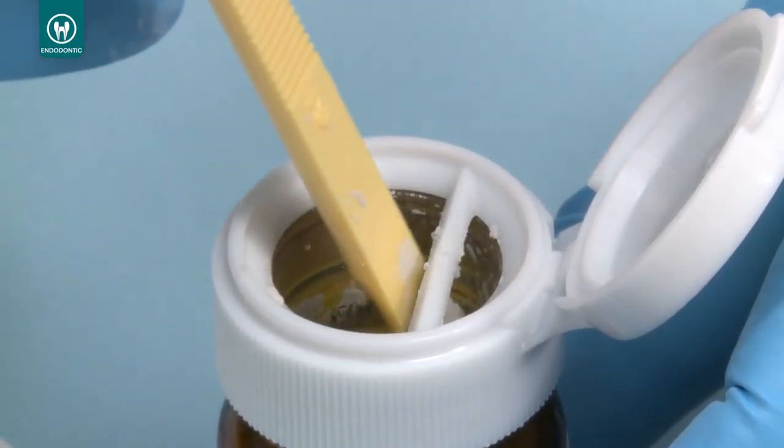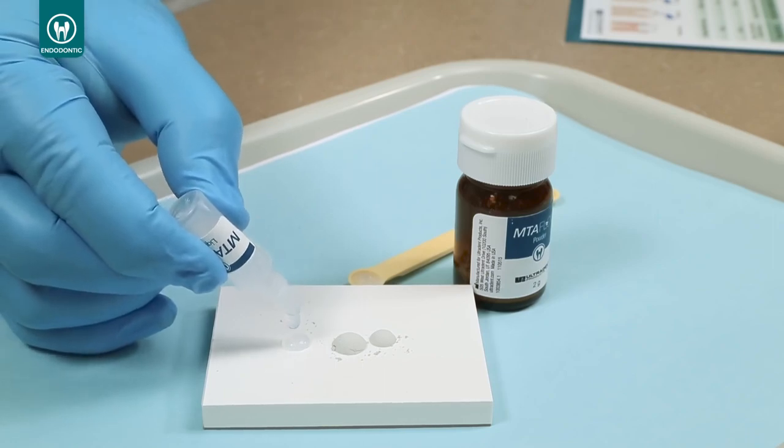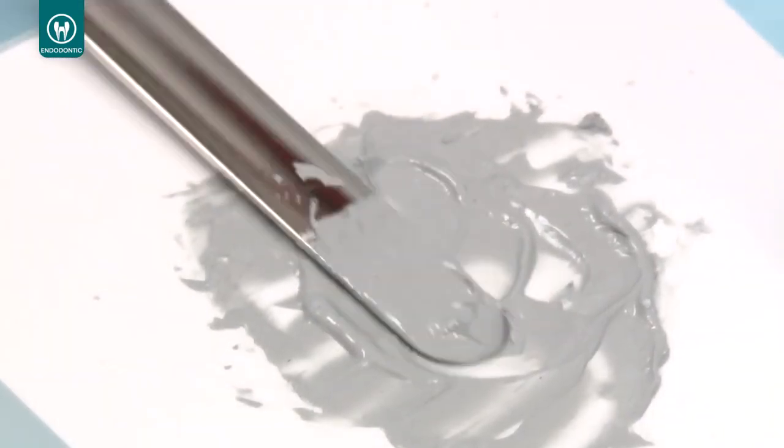Using MTA Flow is easy. Simply measure the appropriate amount of MTA powder and gel needed depending on the procedure. Mix to a smooth consistency.